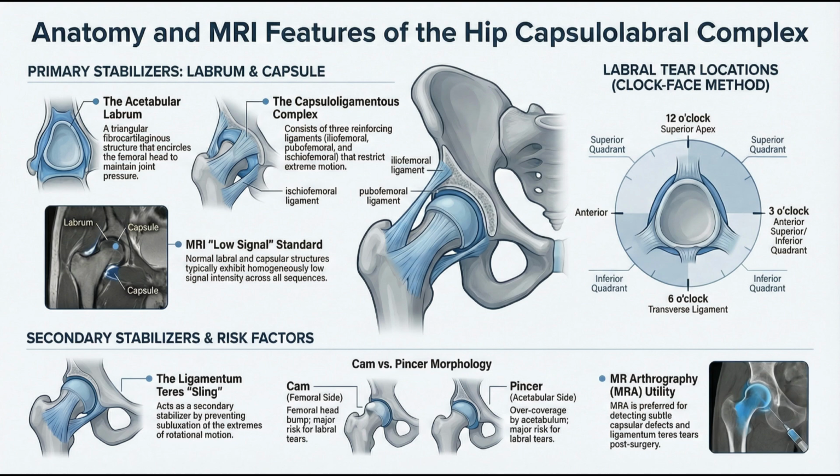I mean, nobody wants a needle driven deep into their hip joint. It's invasive, it's uncomfortable, and there's a risk of infection, however small. But the dye expands the joint and creeps into those tiny tears, making them show up bright white on the scan. For a long time, it was the only way we could see the detail we needed. But now we have the 3T.